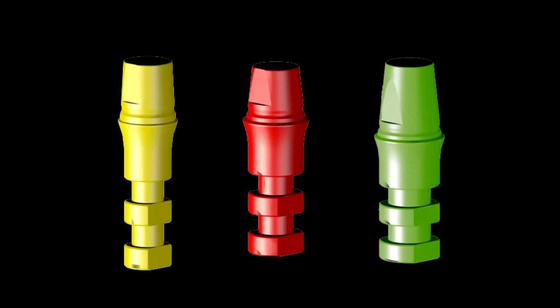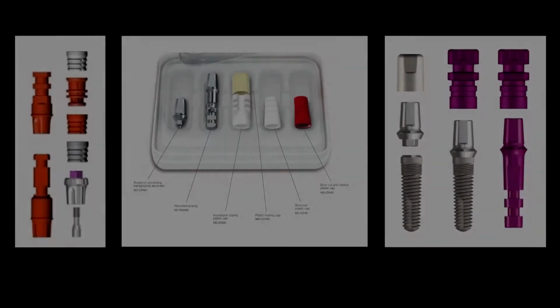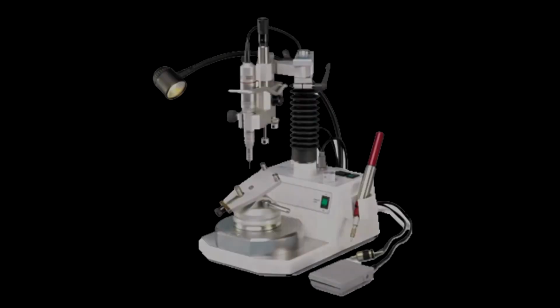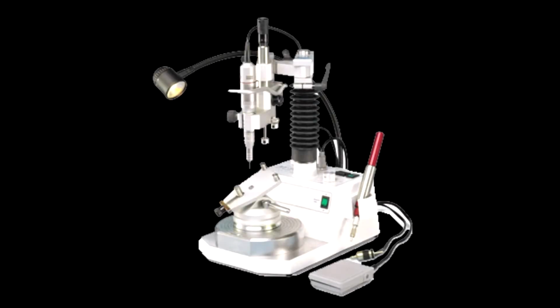Many companies recognize the necessity of having abutment duplicates, and they offer various replicas for standard abutments. However, their use is possible only when abutments do not require additional individual processing.